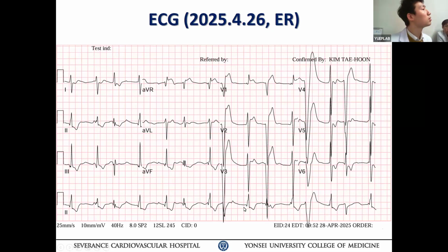Okay. Next one. There's this, which is occurring within the T wave. So either a retrograde P wave from this complex or a dissociated P wave. And this is also too close. Even though the PP is not regular and the morphology sometimes looks like a retrograde P, the P-QRST relationship is not regular, right? Yes. So it's real AV dissociation, as Kofi pointed out in the previous ECG.